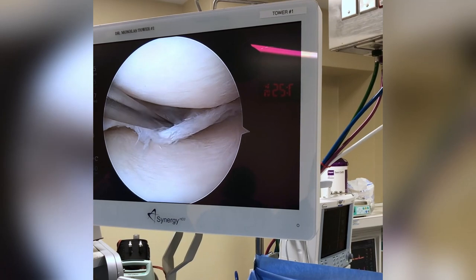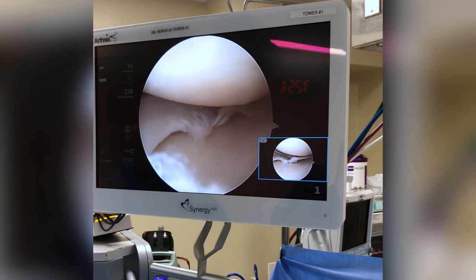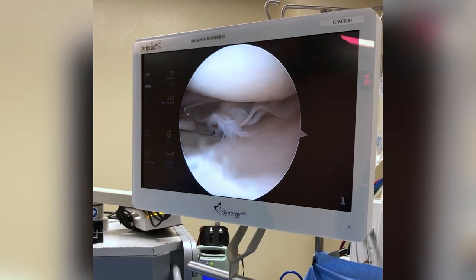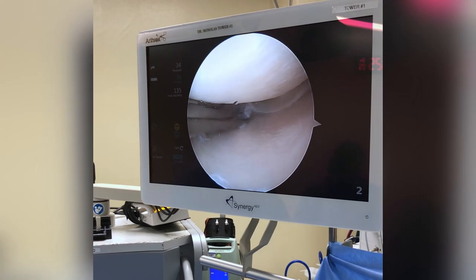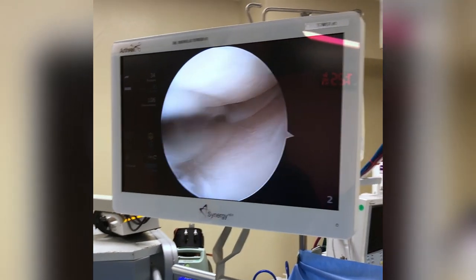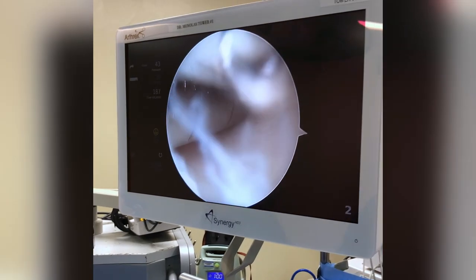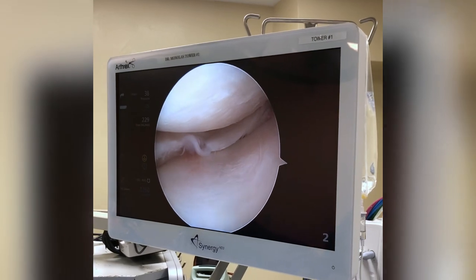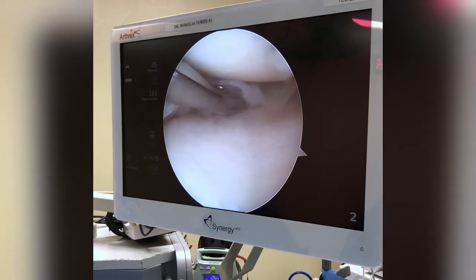You see how that comes in this way — this is unstable and won't really work well. This is why he's got pain, instability, and discomfort. So we take something called a basket forceps in order to trim away that meniscus. Unfortunately, if we try to sew it back it won't really hold — the gentleman is 46 years old. We use a combination of shaver, upbiter, and basket forceps in order to trim away what's torn.